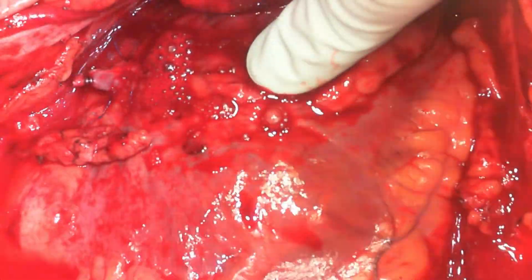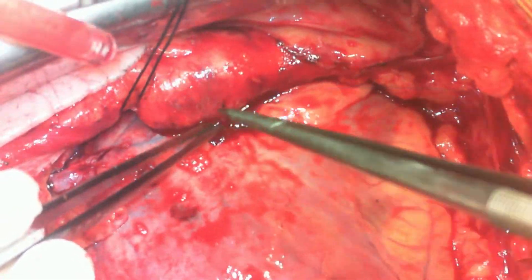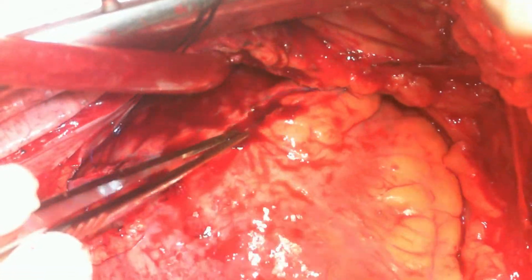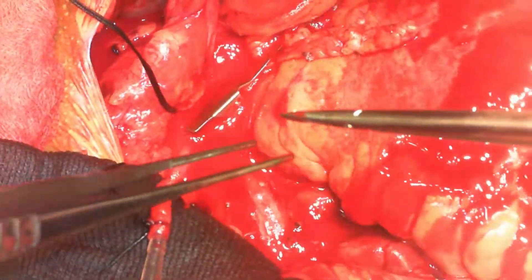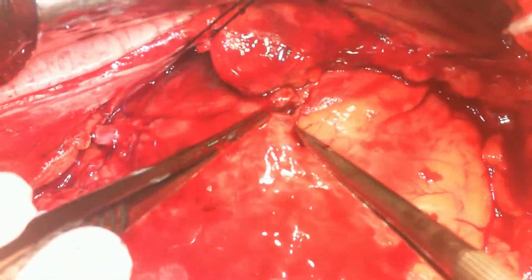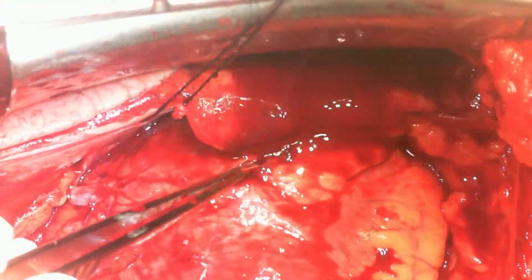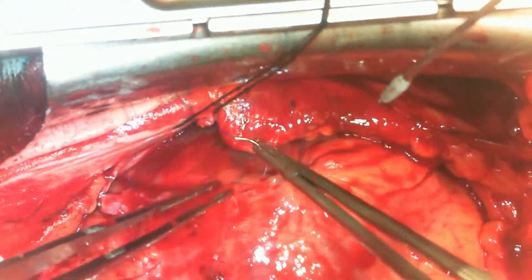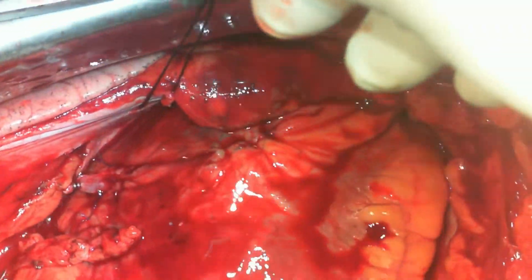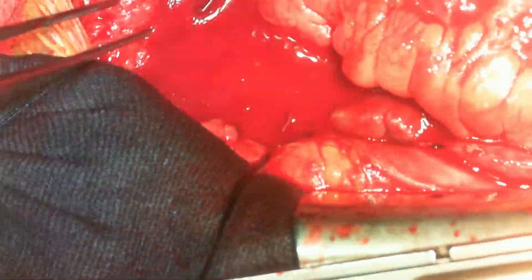Take a 5-0 or 4-0 suture and go parallel to the LAD. Take a stitch parallel to the LAD on either side and gently approximate the LV to the RV. You are not occluding the LAD — the LAD is flowing between these muscle fibers — you are just trying to bring the RV wall against the LAD. The suture may occlude the LAD, but the pressure within the RV is less than arterial pressure, so this gives you some time to expose the LAD proximally or distally and graft it accordingly. I took a suture like this to control the bleeding and give time to go on cardiopulmonary bypass and handle the problem accordingly.